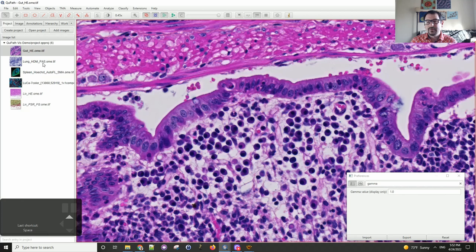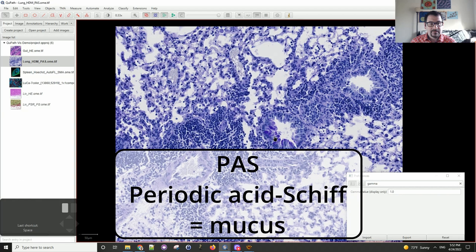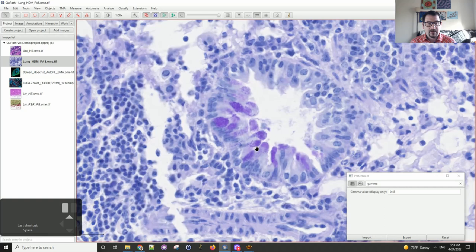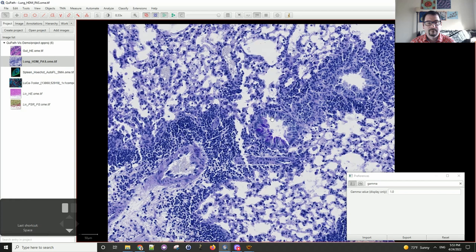Now let's move to a different image. As I mentioned, rotation is transferred between images, so we'll probably want to go back to zero rotation and gamma back to 1. The stain that we see here is not visible in a very nice way, and the goal of visualization is to make it easier for us to see what we're dealing with so we can quantify it more easily later on. That's again where changing the gamma value can help.